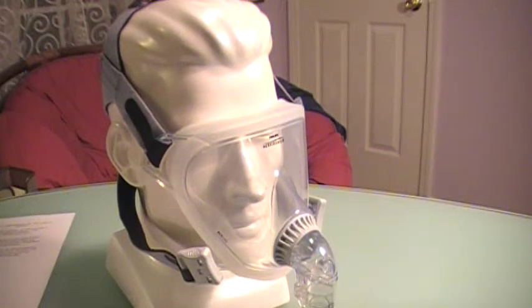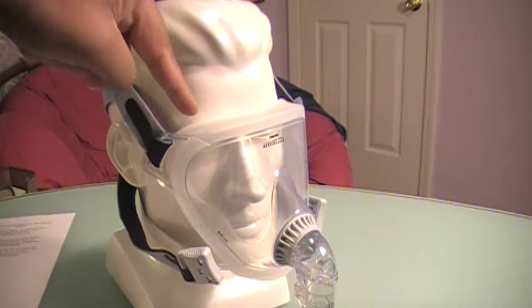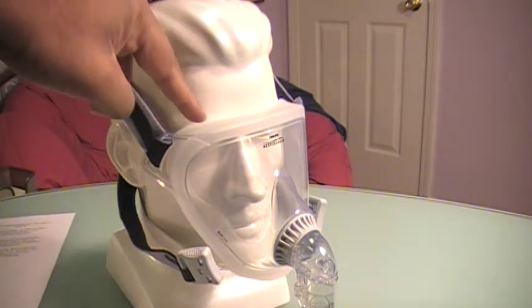Welcome back to cpaphelpdesk.com. In this video, we're going to review the strengths and weaknesses of this mask called the FitLife Full Face Mask made by Respironics.